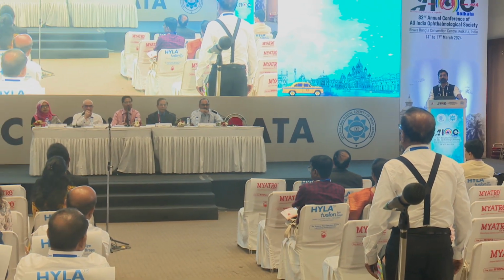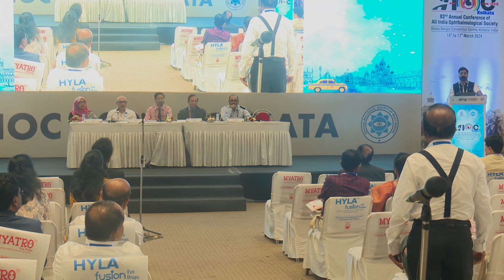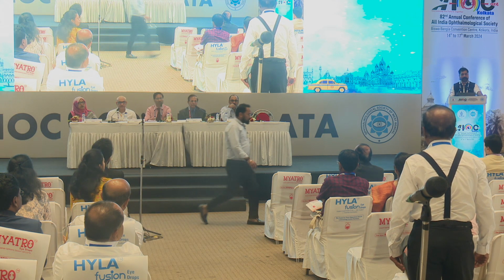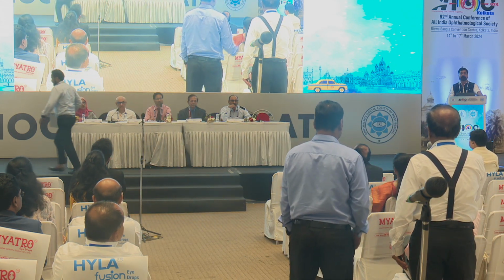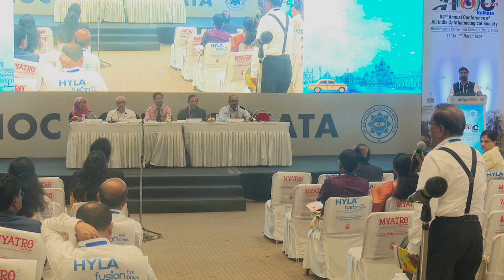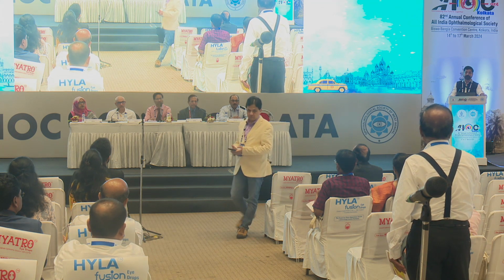Nobody explained about the intracameral use of adrenaline, and I think we are forgetting the subconjunctival use of gentamicin and dexamethasone at the end of every cataract surgery. Still, I think dexamethasone has a good role as far as inflammation is concerned, and with adrenaline, intraoperative miosis is prevented and bleeding is prevented. I am using adrenaline in each and every case in the AC maintainer through that line. In rheumatoid cases, cycloplegics and all other things are not useful.